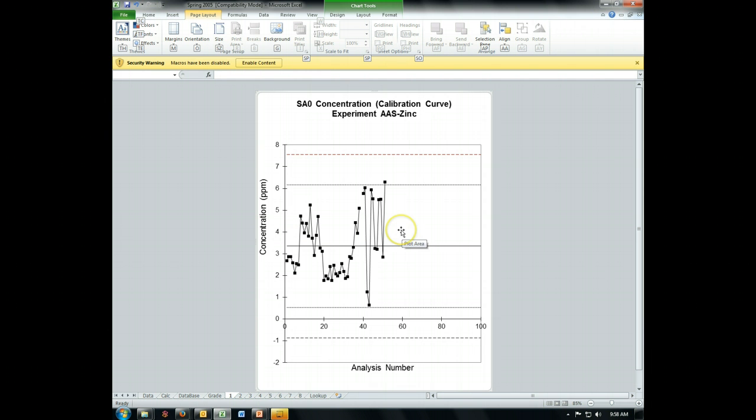Now if you have 14 points that are alternating up or down, that's a sign that something weird is happening too. 1, 2, 3, 4, 5, 6, 7, okay. That broke the pattern, so we were fine. Same here, not a pattern. We got another zigzag going, so you go down, up, so 1, 2, 3, broke the pattern. So you can see that randomness should break patterns. When patterns start building up, that's something that tells you something's wrong.